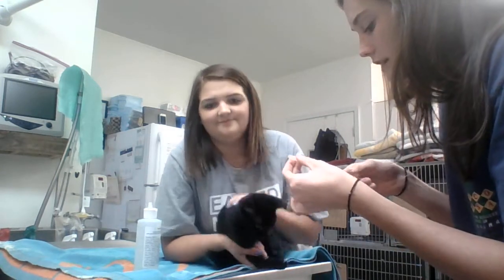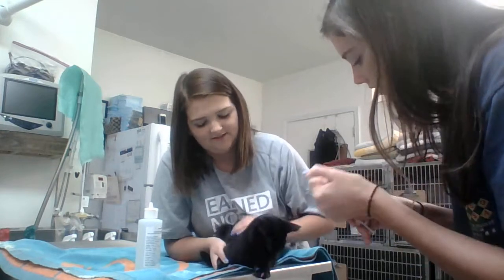And then I'll put my little seal back on. And then I have my blood. So yeah.